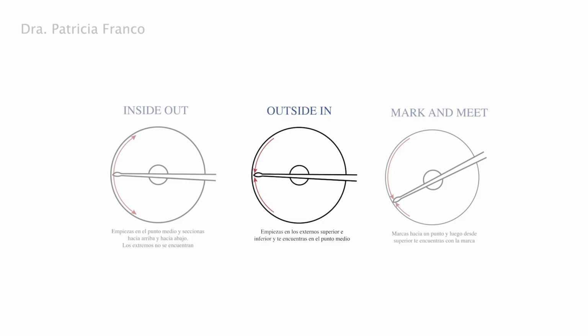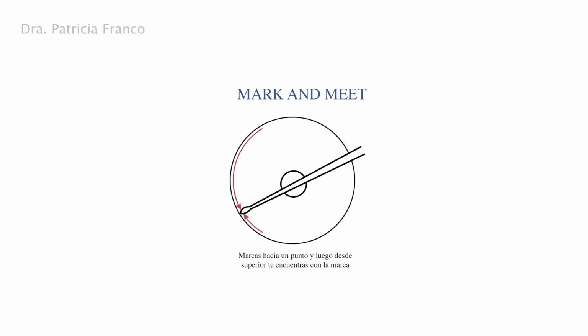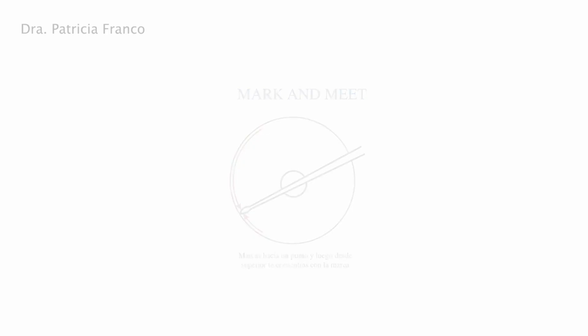And last, the mark and meet technique. This is my favorite. You start inferiorly to make a mark, and then you enter superiorly to meet the end of the first mark. In this case, the ends do meet also.